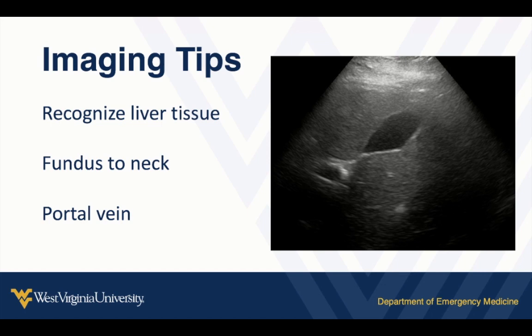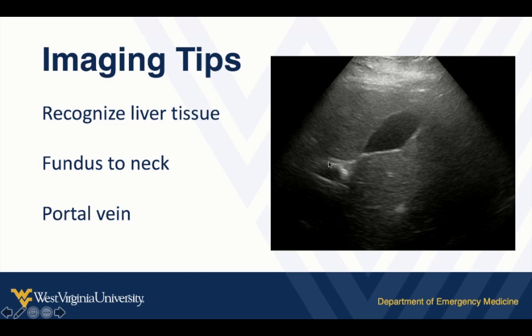It's important to recognize the hepatic parenchyma — a homogeneous, gray, faintly speckled tissue usually seen on either side of the gallbladder. It's very important to examine the gallbladder all the way from the fundus down to the neck. If you miss a little piece and don't scan through completely, that's where the stones will be. Following the gallbladder from fundus to neck usually helps you identify the portal vein, where the neck empties into the duct, and that's where your common bile duct lies.